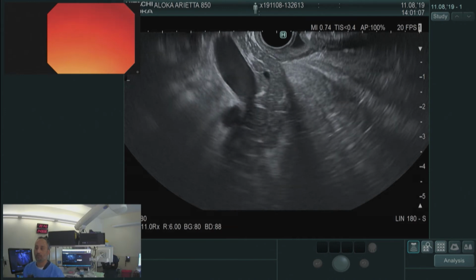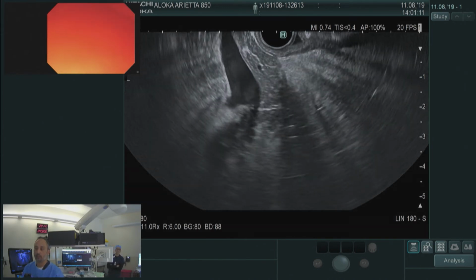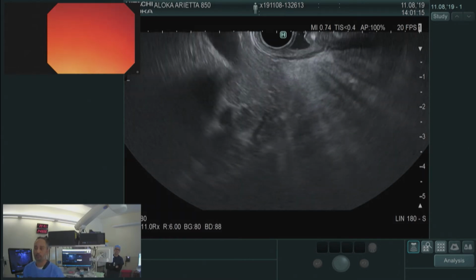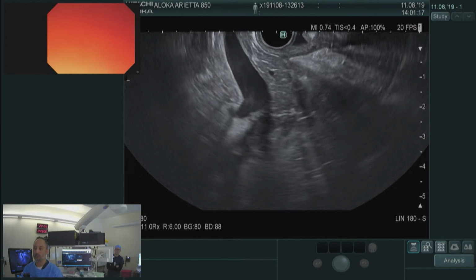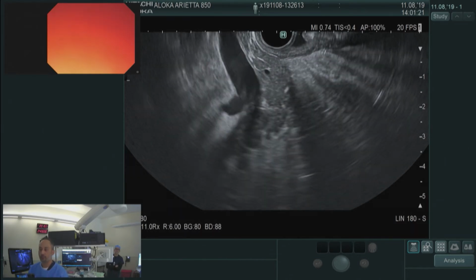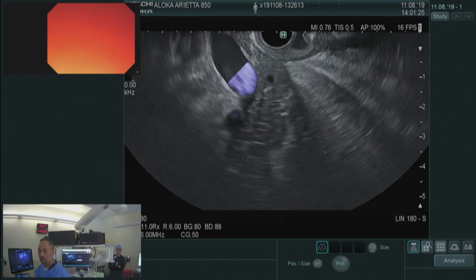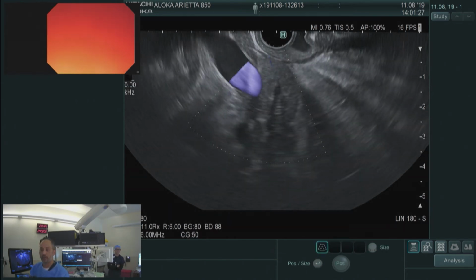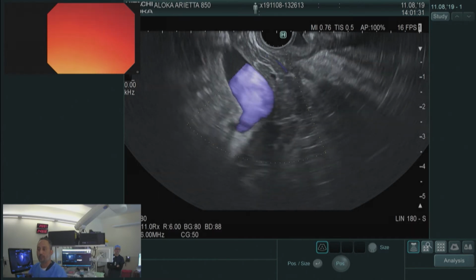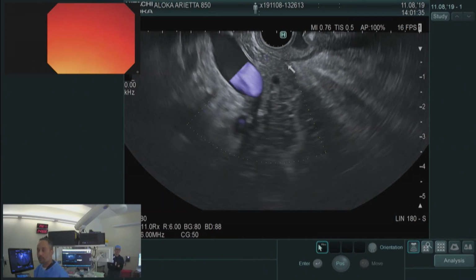I'm just going to walk through the ultrasound, and then we'll go through the diagnostic exam. I think it's important that we cover these bases, and then I'm going to put it to the panel and open it up and see what we want to do. So I'm in the bulb here, and this is just a quick review for our diagnostic ultrasound. So we have our bulb view here. Put on Doppler to confirm for us. There's our portal vein coming down to our portal confluence. Very nicely, we see it there. And of course, in the middle of the screen, we have our main pancreatic duct.